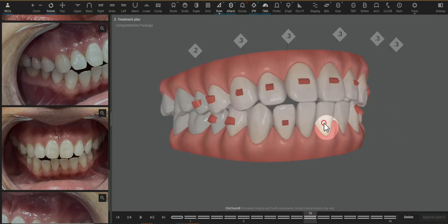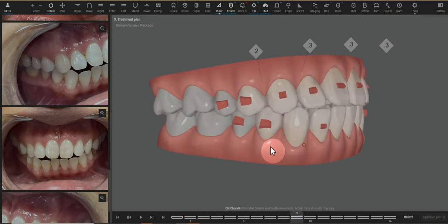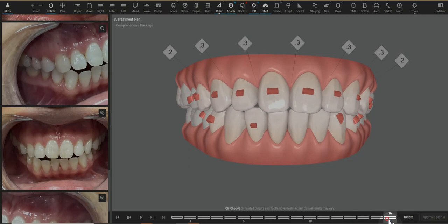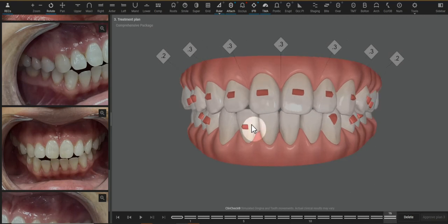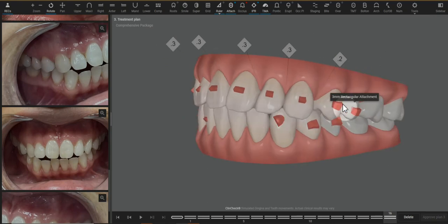Her teeth have both a vertical and a horizontal anterior open bite. We can help the vertical aspect with the optimized extrusion attachments. Anterior open bite cases do require a lot of attachments. We also need retention attachments — these are called retention attachments, not anchorage attachments, because they are meant for the aligner to be engaged and retained on the arch.